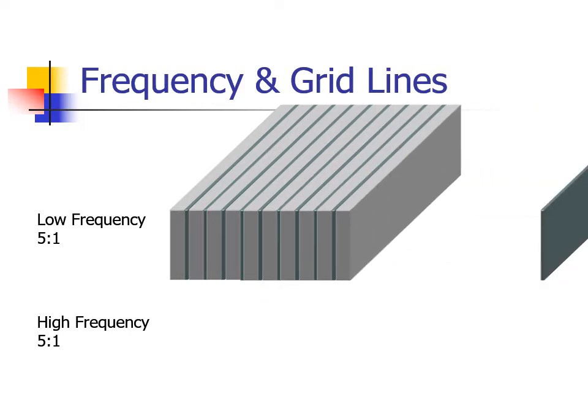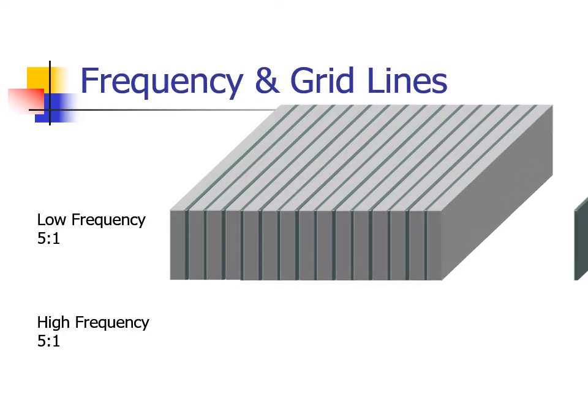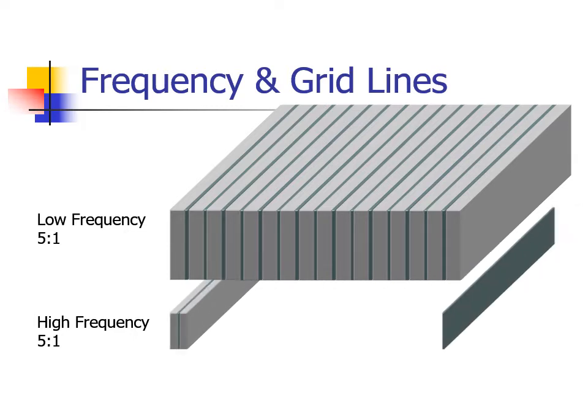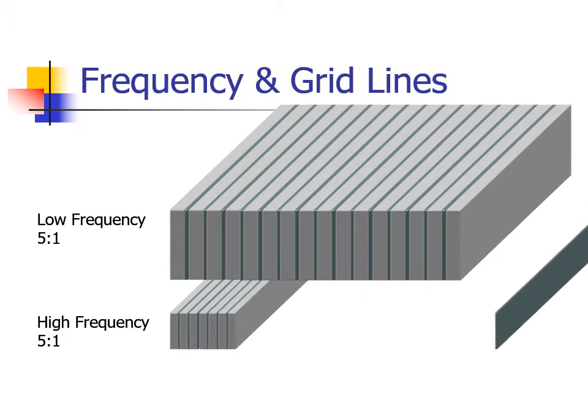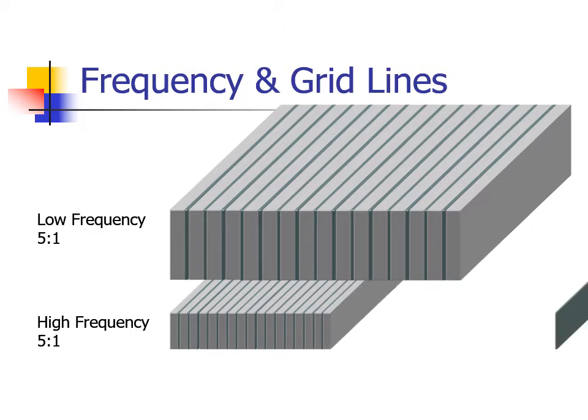We are building two grids. Both have the same ratio, but they have different numbers of grid strips per inch. Since the ratio is the same, both grids will clean up scatter equally and have about the same margin of error. This characteristic is called grid frequency. As the second grid is built, it takes twice as long to construct. For this example, it is easy to see that the high-frequency grid will be more costly because it requires smaller materials and more exacting precision in its construction.